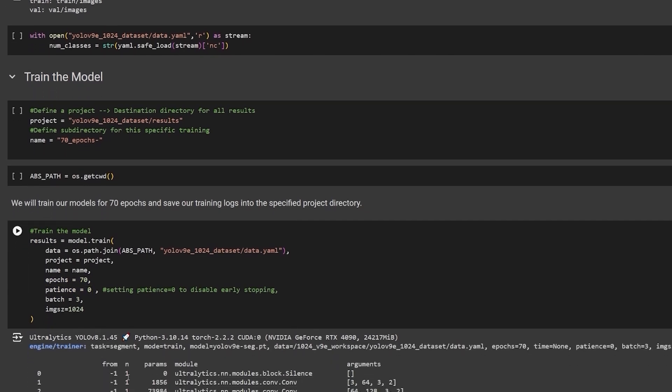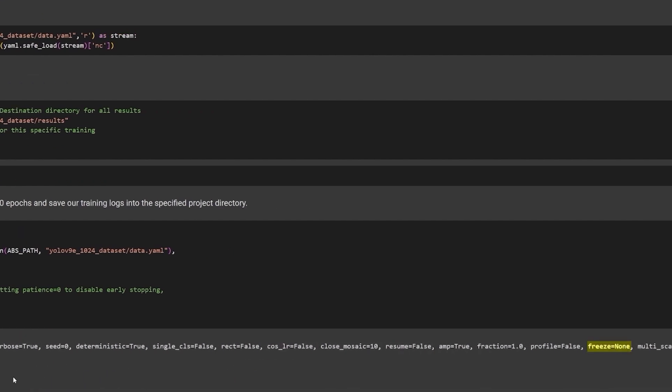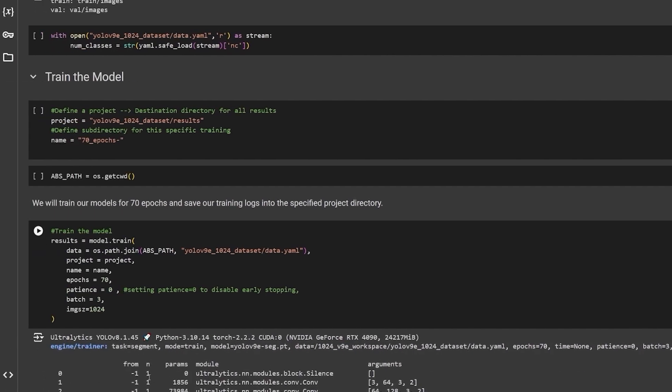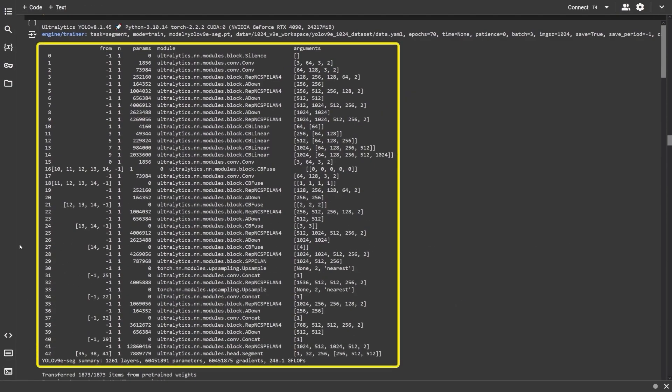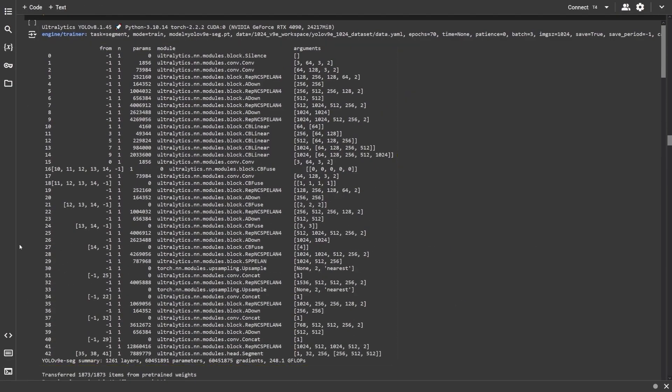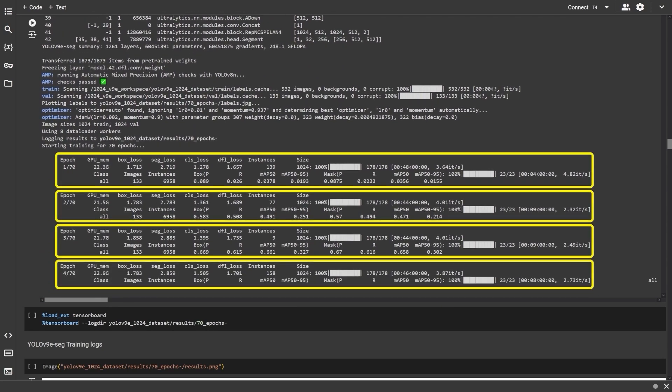When we run this cell, Ultralytics loads other training options like the task at hand, freezing layers, augmentation and lots more. This is the YOLO v9 model architecture. For each epoch, it prints the GPU memory used, the various loss functions, number of instances in the current batch, note that the number of instances keep changing for each batch and finally, the input image size for training.